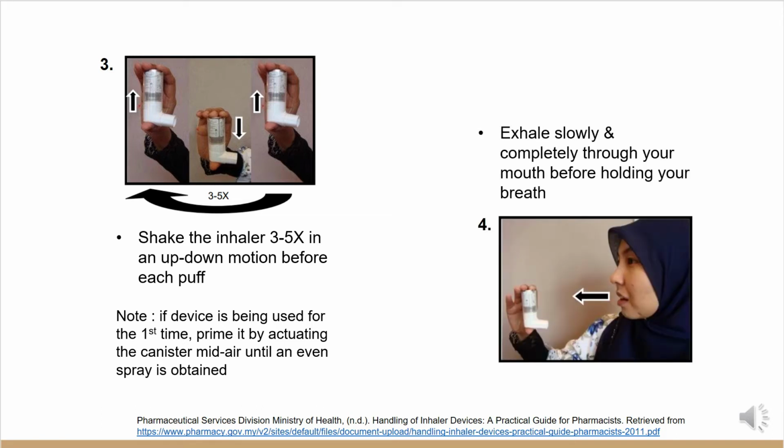Later, they need to exhale slowly and completely through their mouth before holding their breath. Please do not exhale into the mouthpiece as this might push the medication further inwards, so they will not get the correct dosage later.